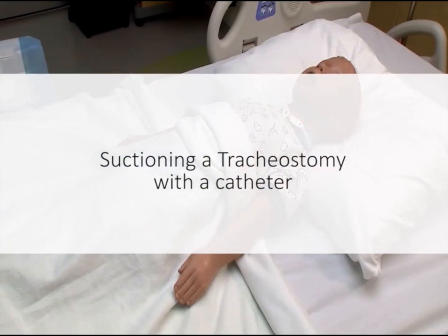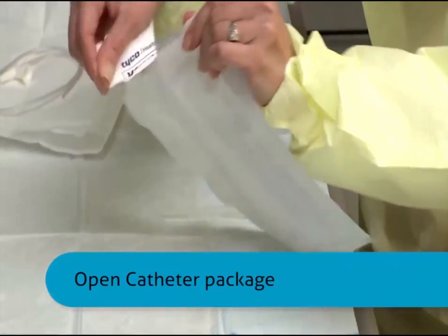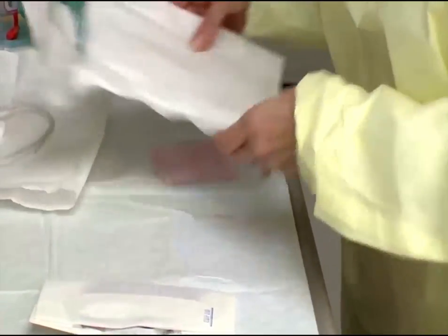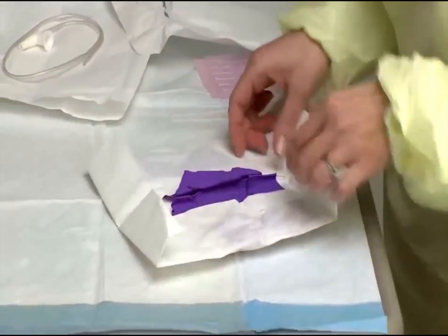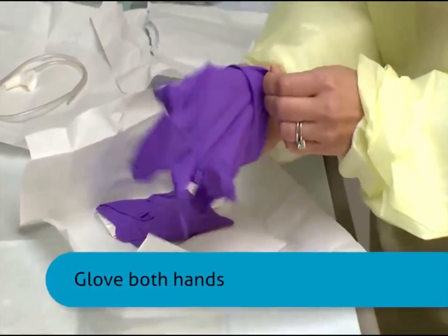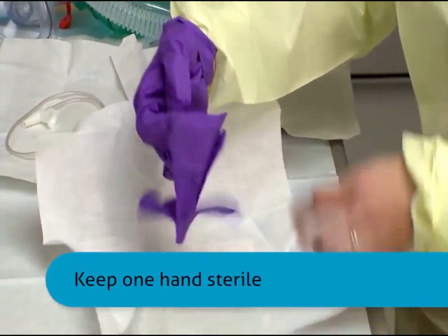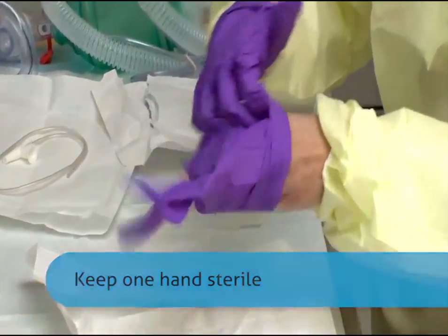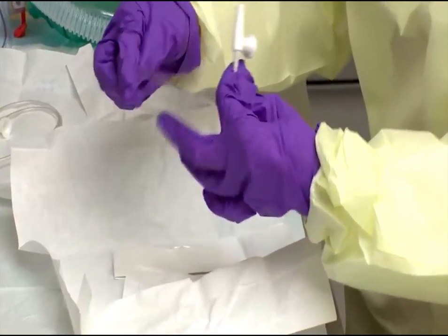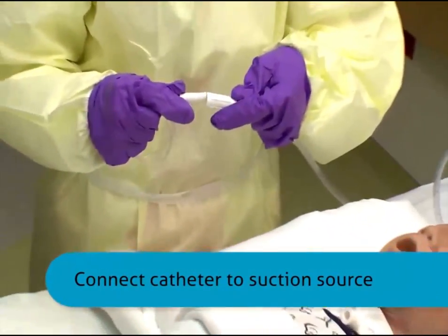First, to suction a tracheostomy tube with a catheter, begin by opening the catheter package, maintaining catheter sterility. Glove both hands and maintain sterility of the dominant hand. Then connect the suction catheter to the suction source.